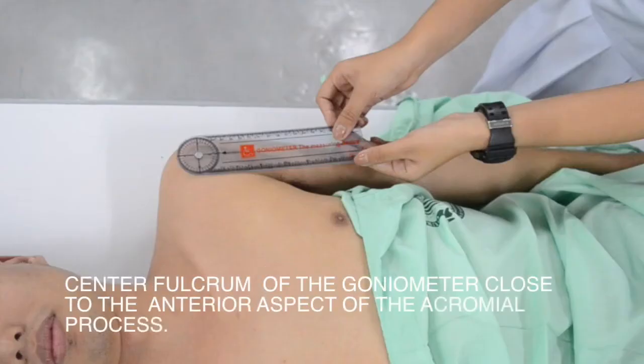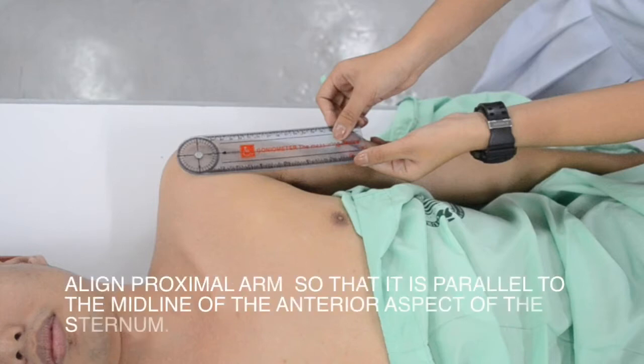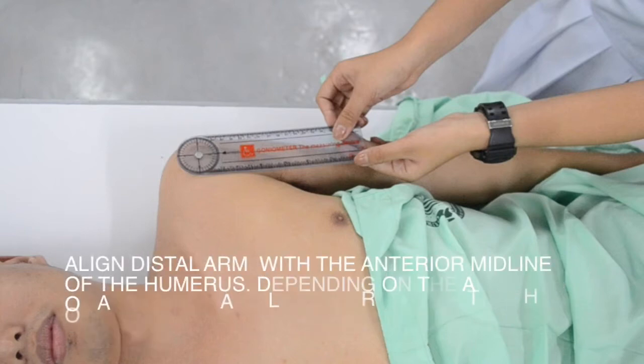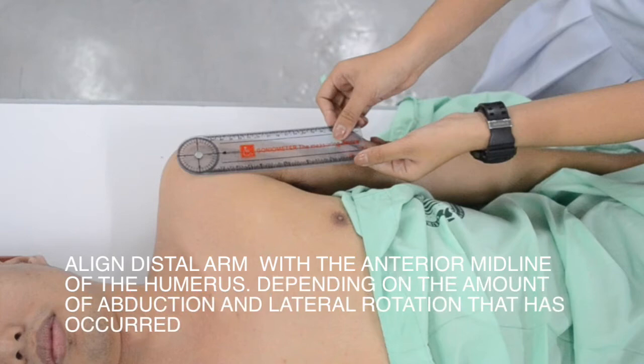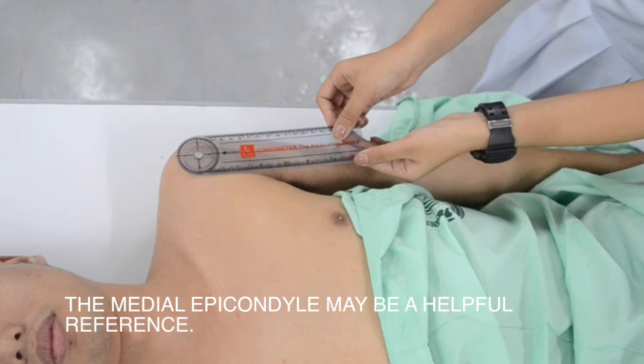Center the fulcrum of the goniometer close to the anterior aspect of the acromial process. Align the proximal arm so that it is parallel to the midline of the anterior aspect of the sternum. Align the distal arm with the anterior midline of the humerus, depending on the amount of abduction and lateral rotation that has occurred. The medial epicondyle may be a helpful reference.